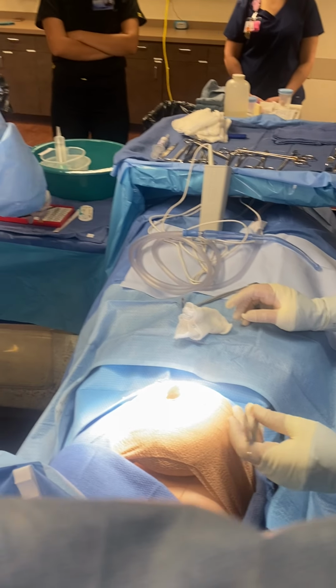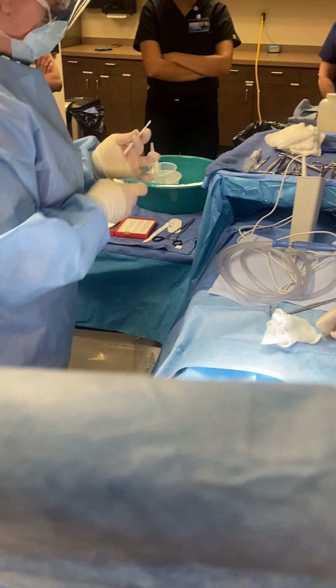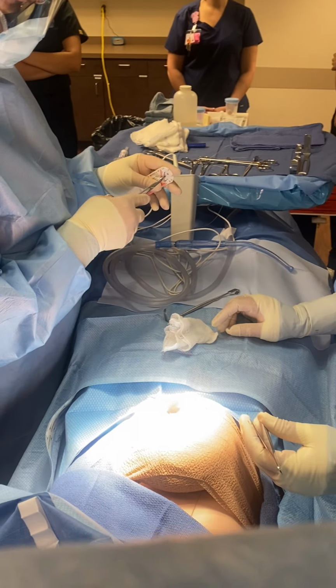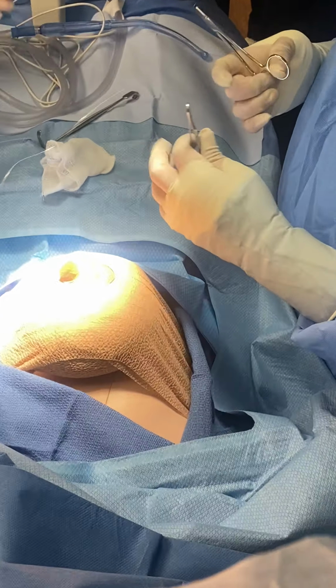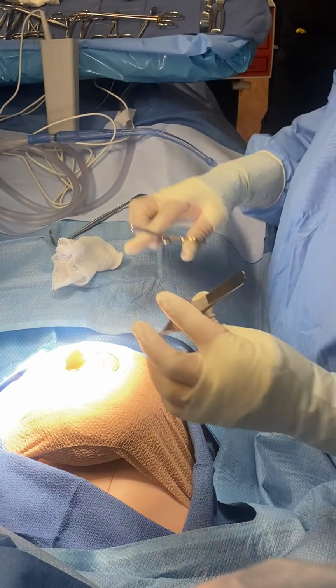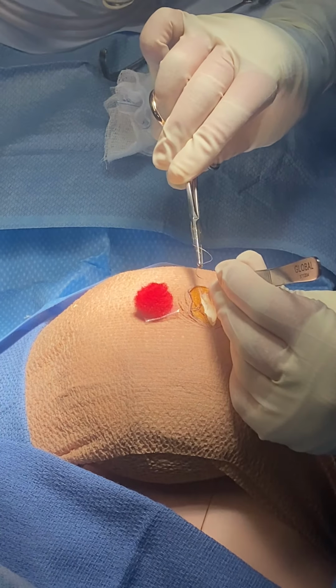Okay, skin stitch. Do you like the Webster or you just want a regular needle? I'll take a Webster. Gives me a little more control of that baby needle. Sorry. Thank you. I can't see those stitches.